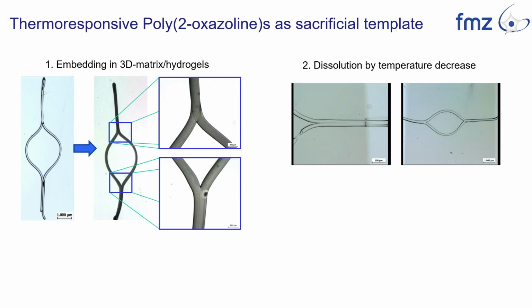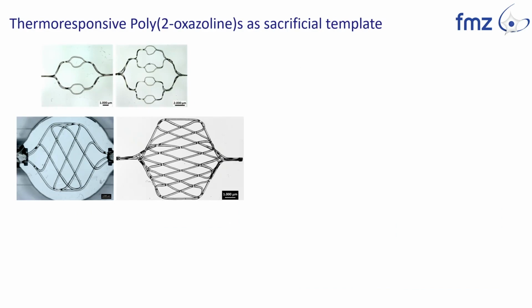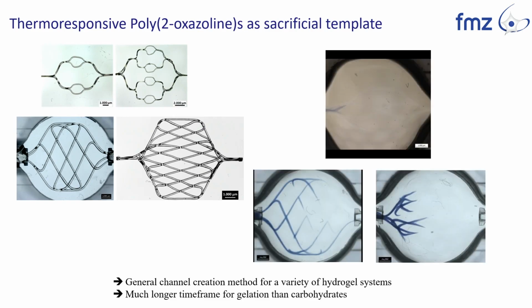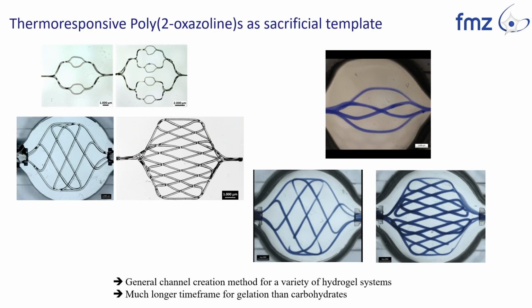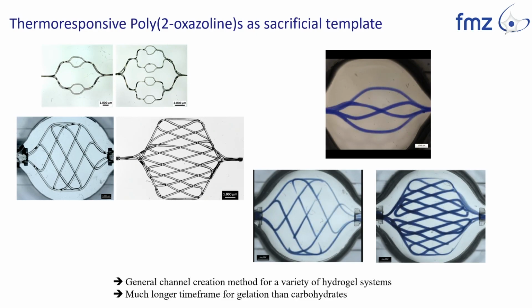So when you embed this scaffold into a hydrogel and decrease the temperature, you can actually dissolve it, and afterwards perfuse this with a dye, with media. You can add cells into the channels. During the development of this technology, we created several different designs, which can all be perfused and used for perfusion cell culture. And the good thing about this method is that it is generally compatible with many hydrogel systems, as long as they are physically stable enough.